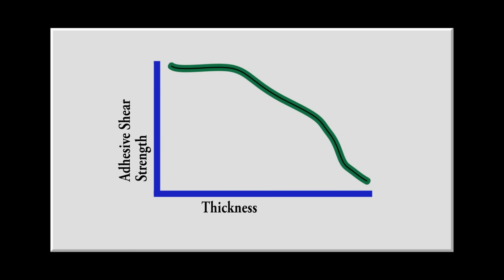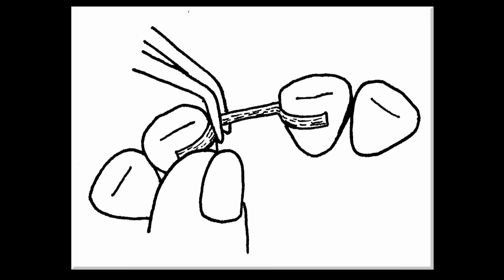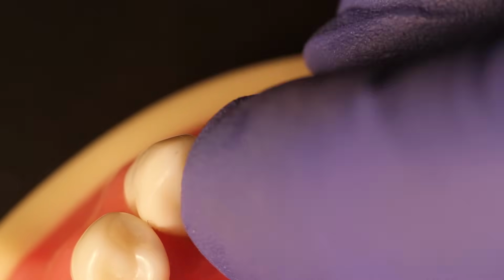increase longevity. Use cotton pliers and bring the ribbon across the edentulous area and adapt the ribbon into the composite on the other abutment. Again, place the ribbon as close to the surfaces of the teeth as possible. If the ribbon piece is too long, cut the excess with the special ribbon scissors prior to curing.